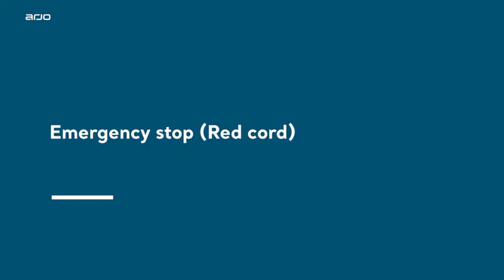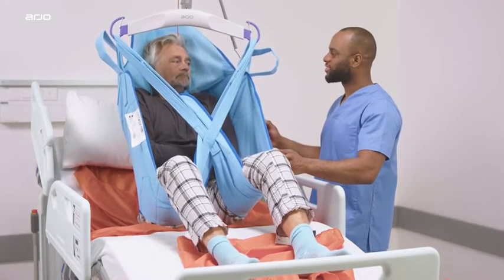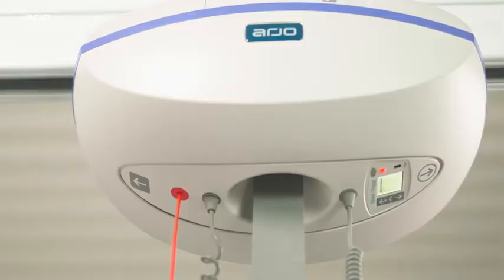Emergency stop, red cord. This device is an easily and rapidly accessible feature, allowing the user to disable the lift completely in the event that an uncontrolled situation should happen. When pulling the cord, the lift stops all activities.